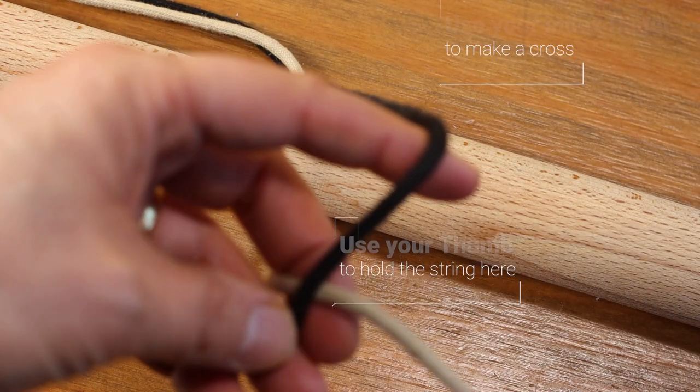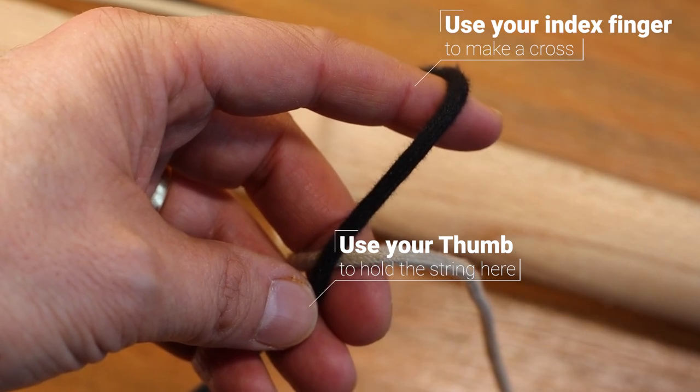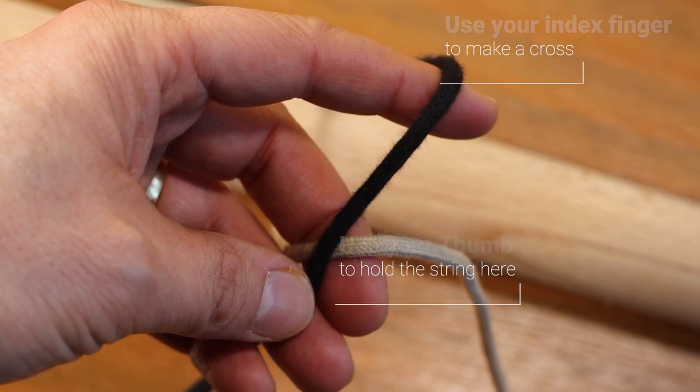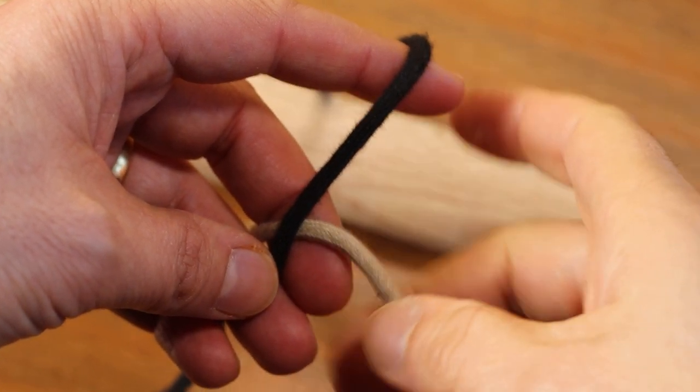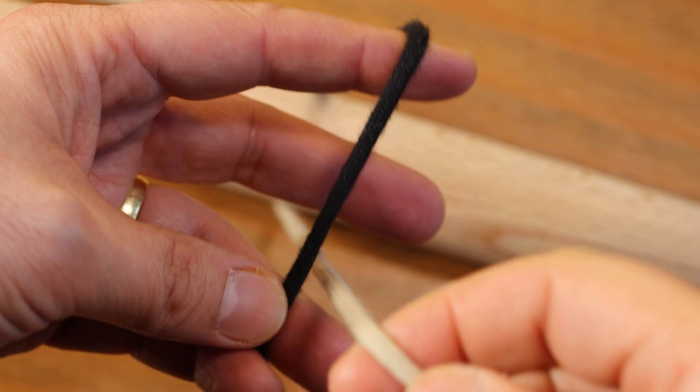Now let's do that again in slow motion. You can see here I'm holding this black string with my thumb and pulling it taut with my index finger. I'll do that again for you here, and now I'm making a cross with the white string.